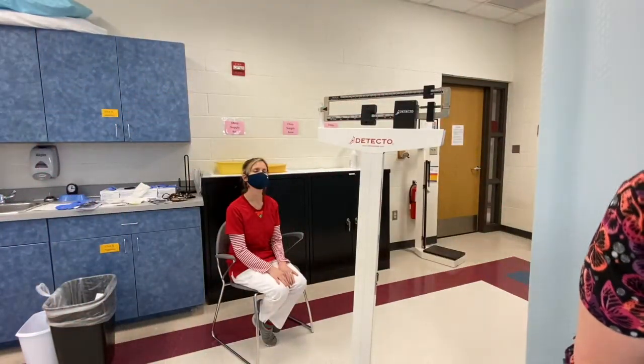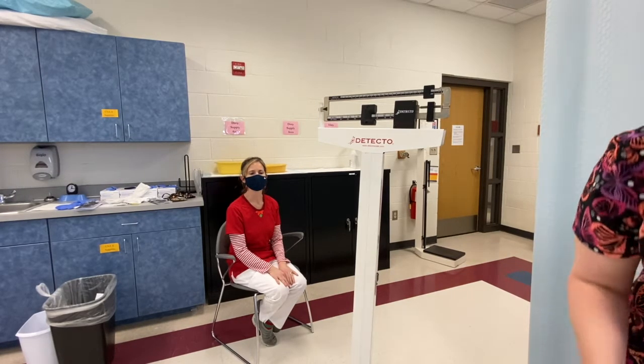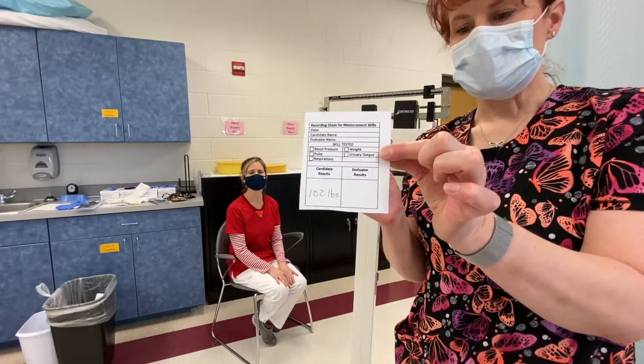So 100 plus 2 — her weight is 102 pounds. I'm going to record 102, and I'm going to make sure that I put a unit of measurement. I've recorded her weight: 102 pounds.